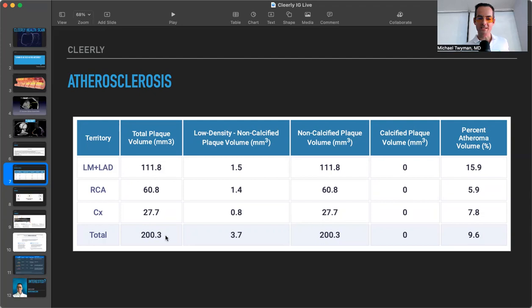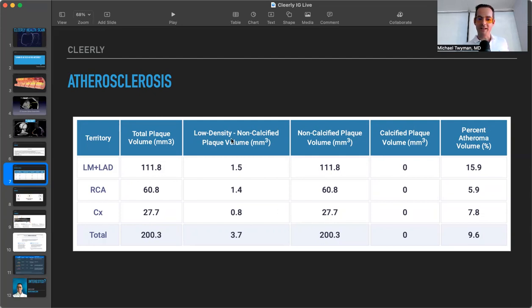We'll get into this in just a little bit. Is 200.3 a low number or a high number? But when I look at this report, I'm looking at this mainly, how much low-density non-calcified plaque is there? Very little amount compared to the total burden.